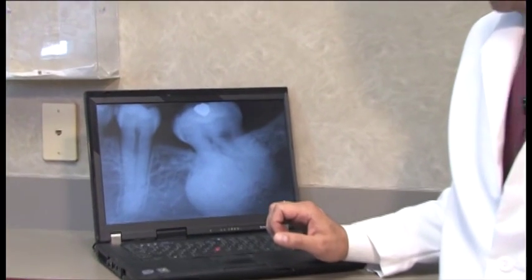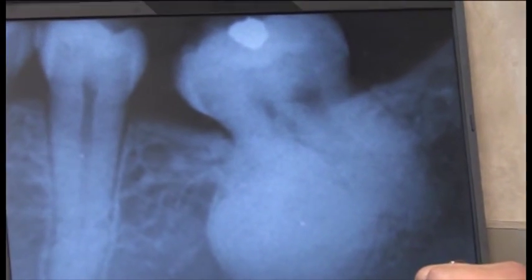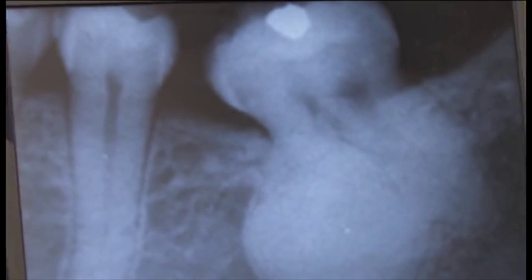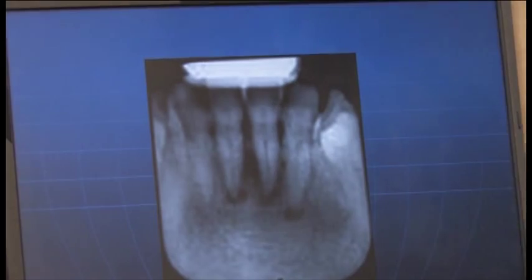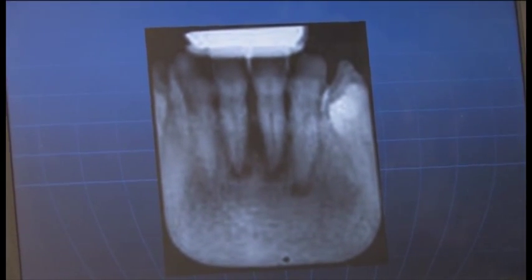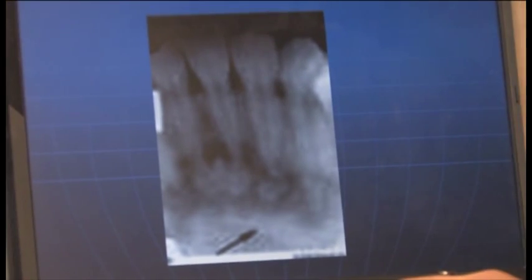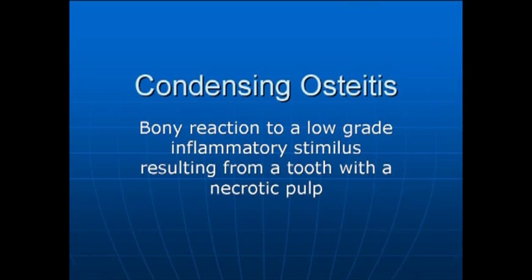My diagnosis would be condensing osteitis. This is a picture of cementoblastoma — it's more of a growth-shaped tumor-like mass and needs to be extracted. This is a start of periapical cemental dysplasia where it's radiolucent and then becomes radiopaque. Condensing osteitis is a bony reaction to a low-grade inflammatory stimulus resulting from a tooth with a necrotic pulp.